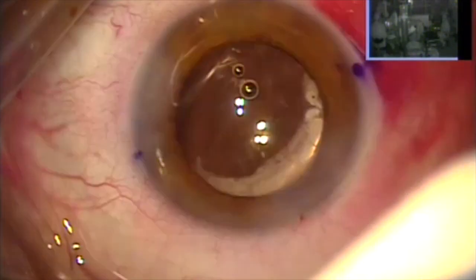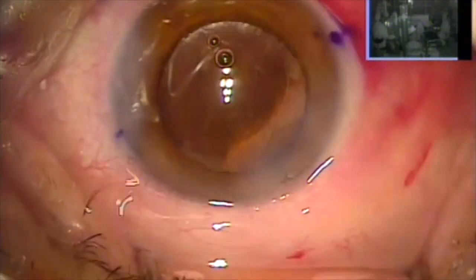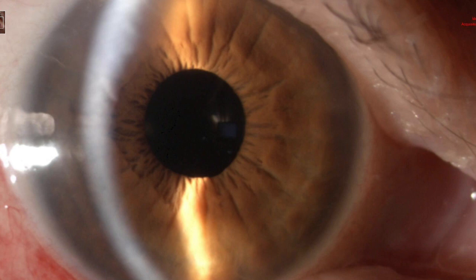Stayed clear cornea — big surprise. The next day, although the pupil is a little dilated from the inflammatory effect, the patient is already 20/25 uncorrected. Due to the pupil dilation on the first day, but the following day we improved to 20/20. You can see here the pupil is far better, smaller. Very happy patient, happy surgeon.